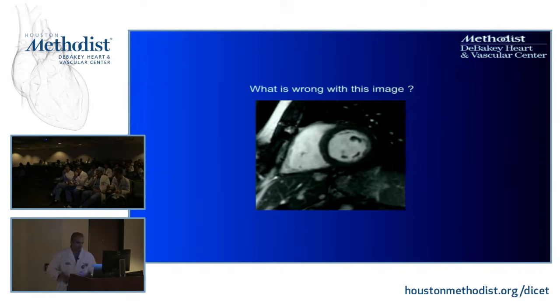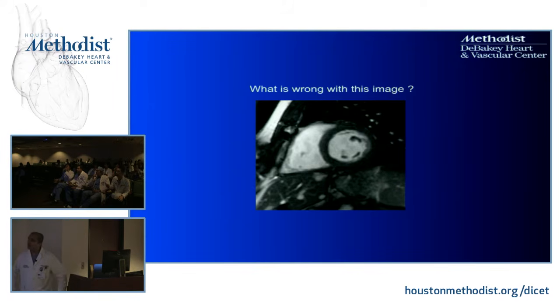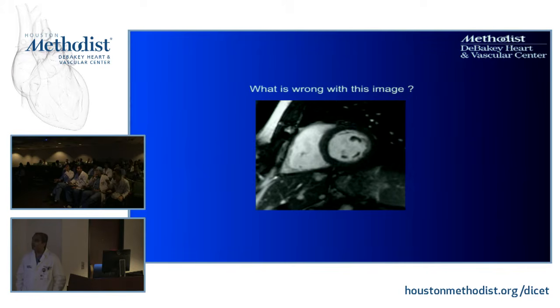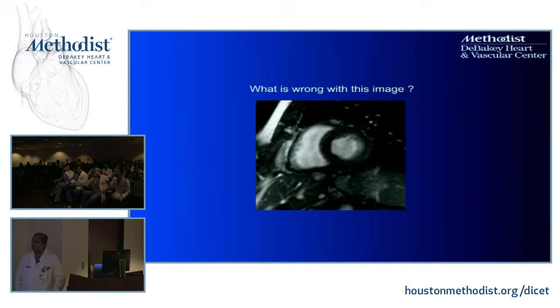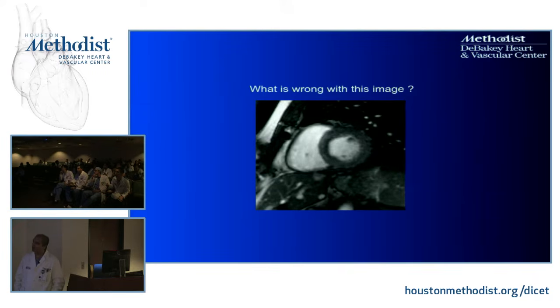Okay, so here's another example. What do we think about this one here? So take a look at it, and how does it look? Seems like there's partial voluming. Okay, partial voluming in what way? Like the LV is not homogeneous. Okay, and so is it the endocardial or the epicardial borders? The epicardium or the endocardium?